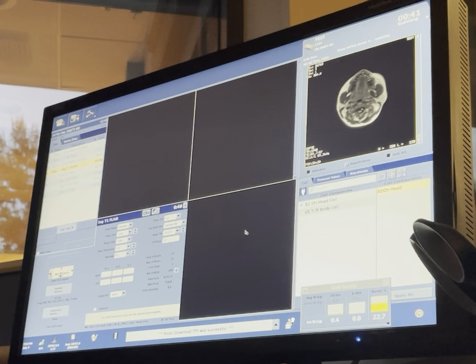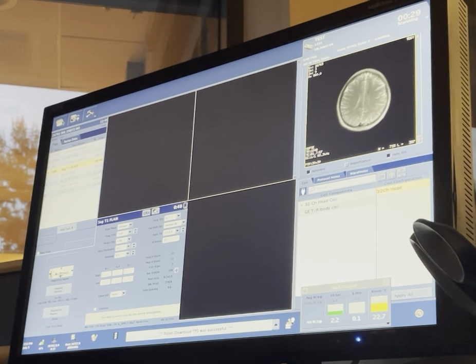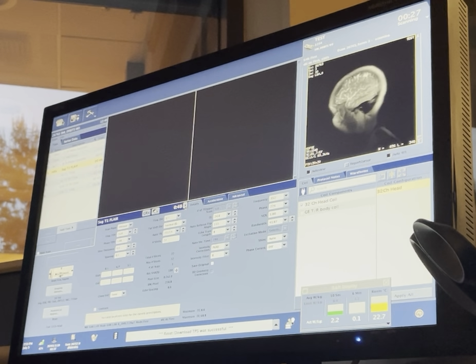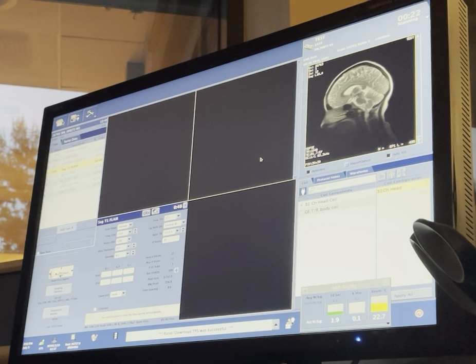So let's open up your axial, and remember to middle click. When you're highlighting your windows before you're ready to drop, always make sure you middle click. That way you can find your slices and brighten them up and everything, and then you can drop your slices. That makes sense? Or you find which image you want to plan off of, and then you can brighten them or do whatever. That looks way better. Okay. We can actually see her eyeballs. Oh, nice.